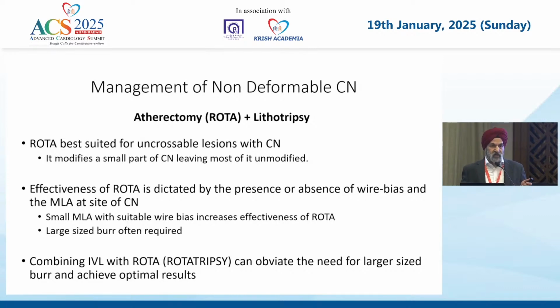But does rota work in nodules? Yes and no both. It does need a suitable wire bias, but most importantly, it modifies the nodule very little. So there is always a need of having large size burrs with a suitable guide wire bias, a combination of these two, and most importantly, what is true even for all the atherectomies in nodules, your MLA at that segment has to be very small. I'll show you a little later on about that also.